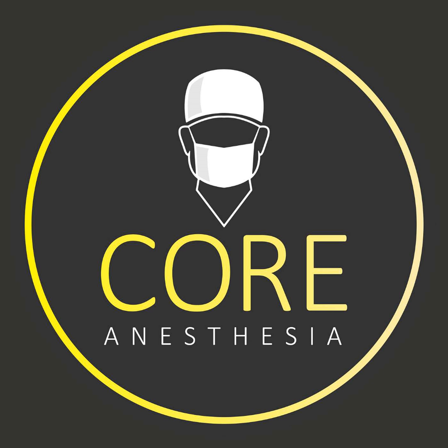And again, you're not cranking backwards on the blade and you're not trying to manually lift that epiglottis out of the way. You're just letting the tip be in the vallecula and you're using your right hand to push down and to line up that view for you. And if that's the case, then I have a circulator, whoever else is in the room helping me, hold that pressure exactly where I have it. I reach back and I do not take my eyes off of that open spot. I do not take my eyes off the vocal cords because without fail, if you look even to grab your ET tube and then look back, something will move slightly and you'll have to restart trying to get that view back. So I never lose that view once I have it.